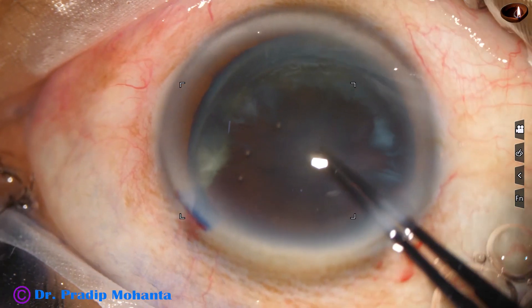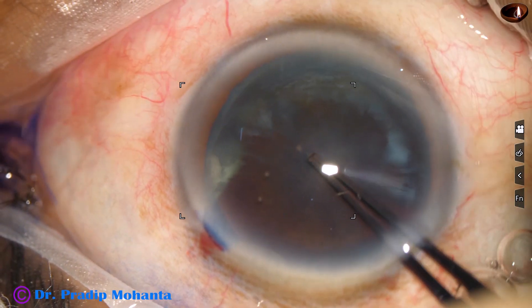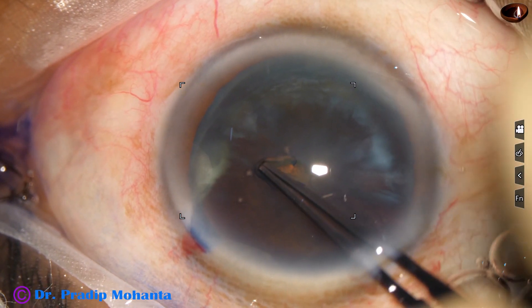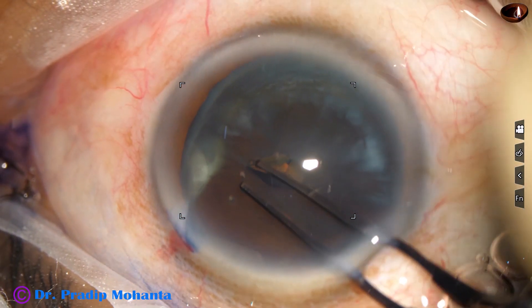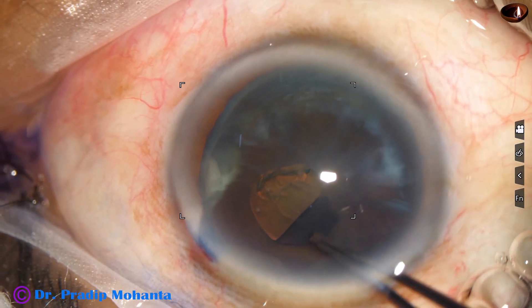The rhexis forceps goes in, pierces the anterior capsule at the center, rips apart and goes towards 3 o'clock. The prongs are opened — one prong goes into the cleft, another one onto the anterior capsule — and we start the rhexis.